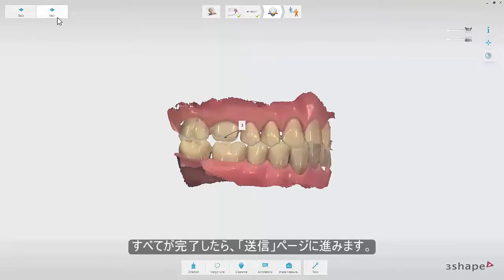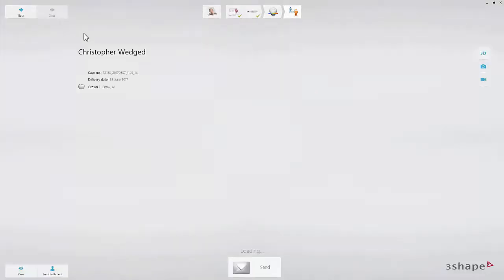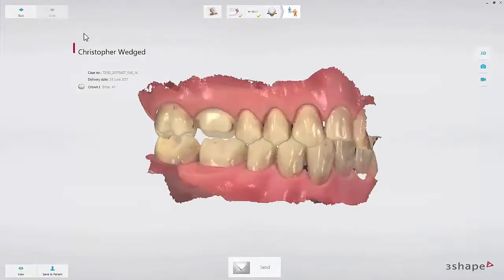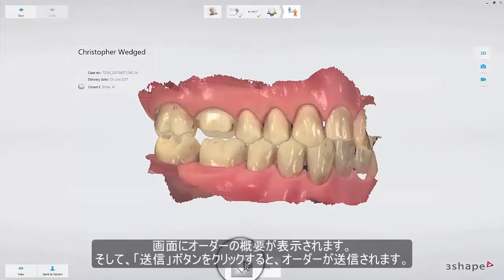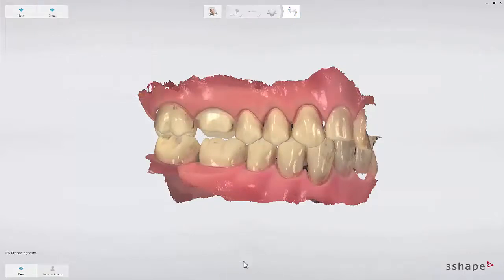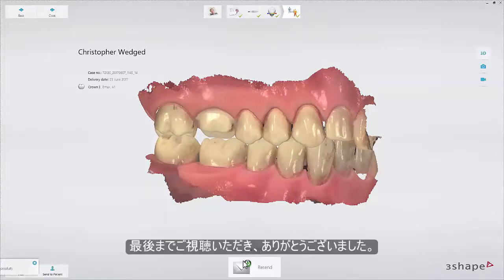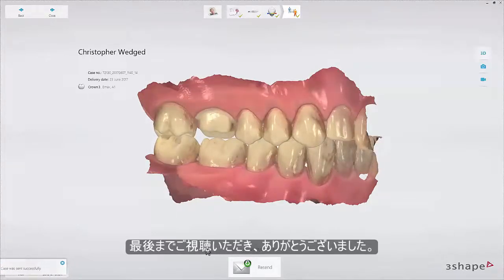Finally, move to the send page. You will see a summary of the order. Press the send button to send the order. Now you know how to make a crown case.